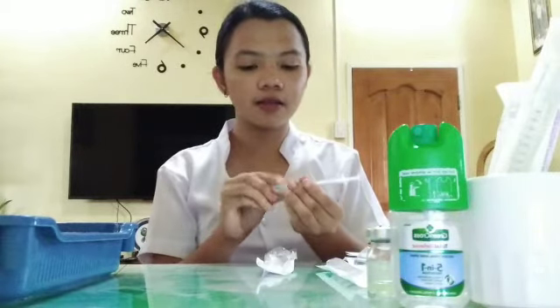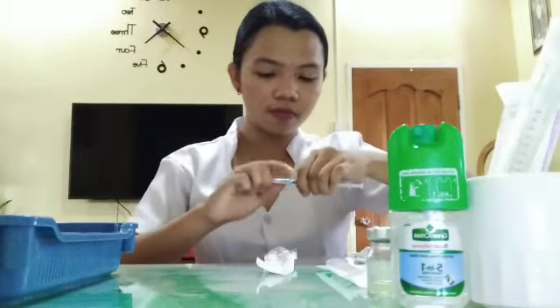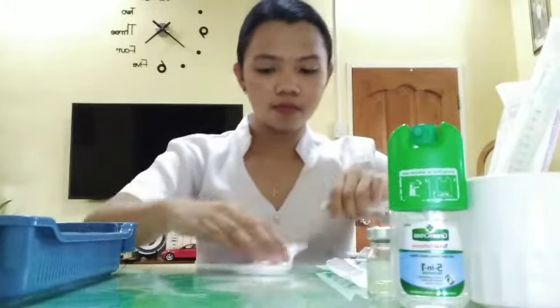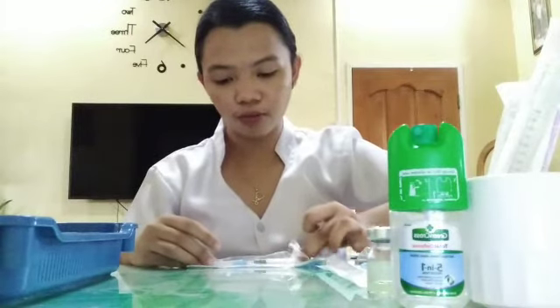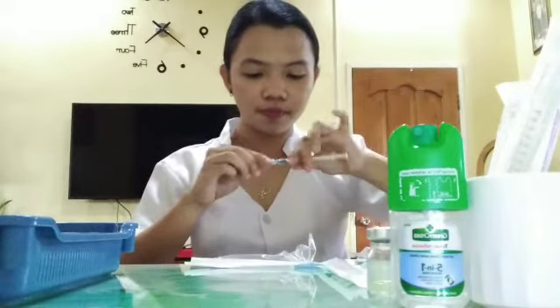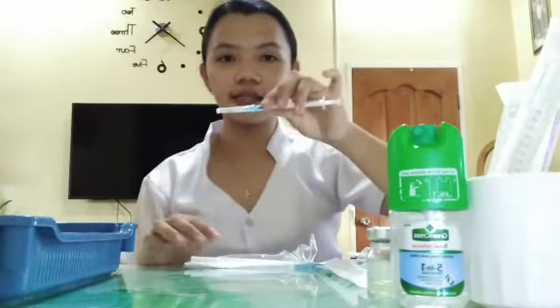So we will change it. Gauge 25 also. So here it is, the new one.